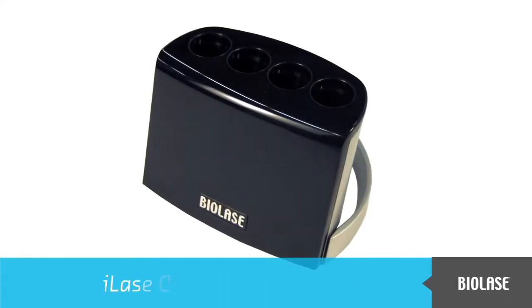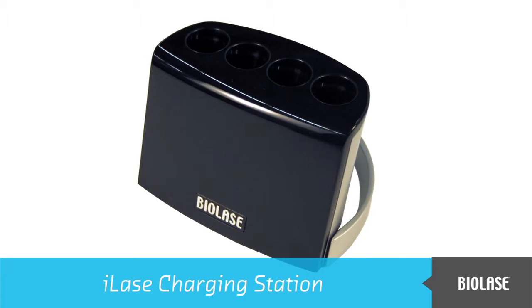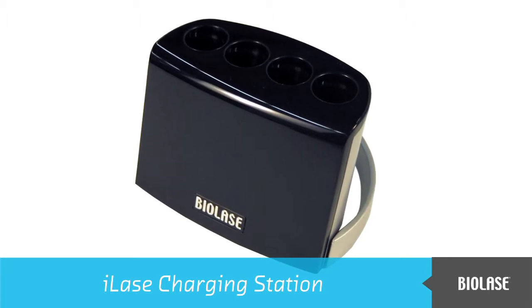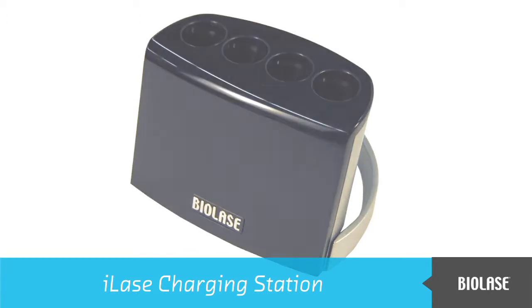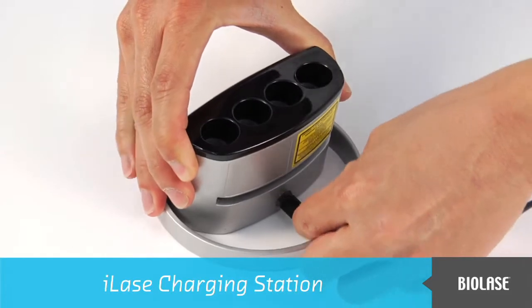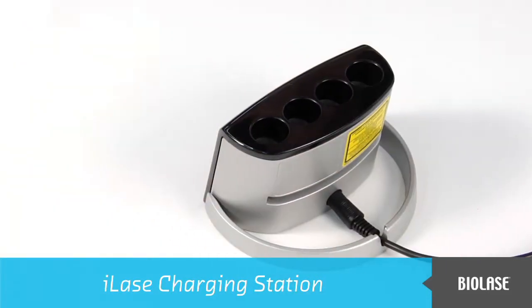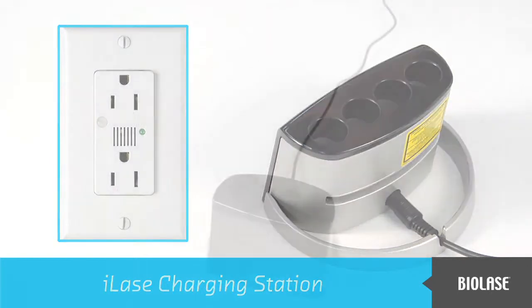Before using the iLase, we should set up the charging station and charge batteries. Place the charging station on a surface where it will not be disturbed or come in contact with liquids or contaminants. Then, insert the power plug into the back of the charging station. And then, insert the other end into an AC power outlet.